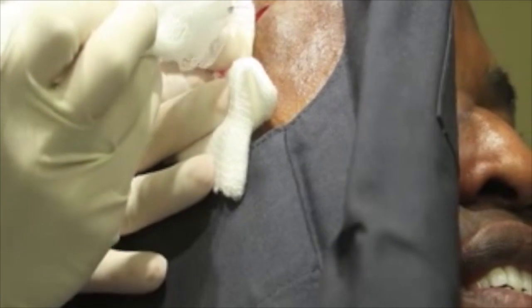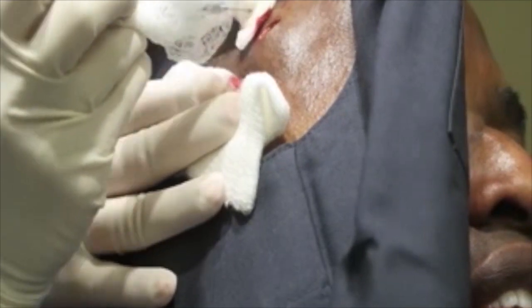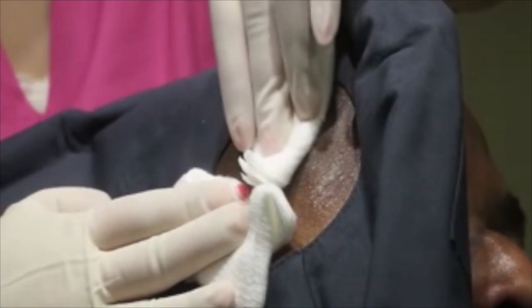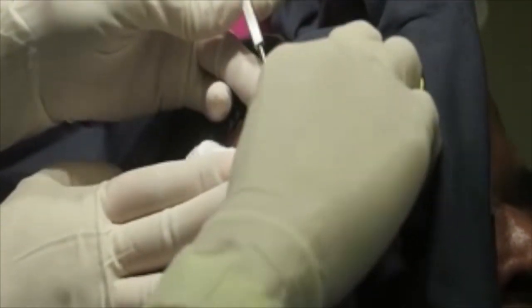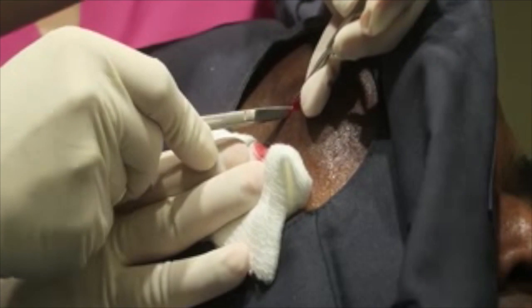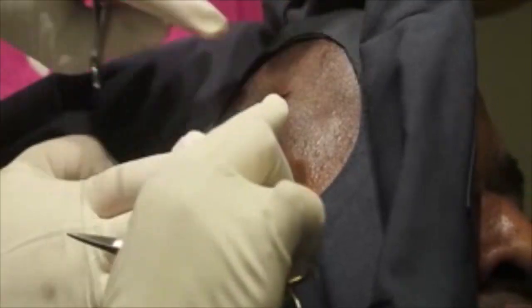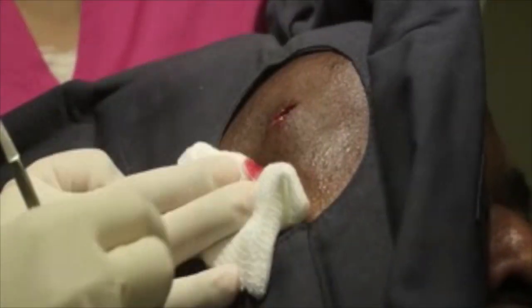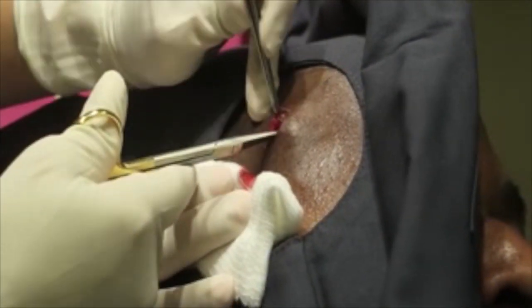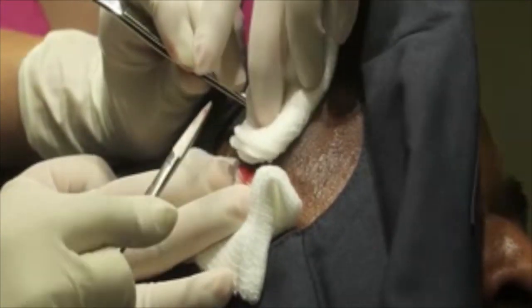A little buzzing noise you're gonna hear, just a cautery that stops little blood vessels from oozing. Okay. Alright, I do think you have a lipoma. I'm just trying to loosen around the edge and see if I can pull it out there. So again, nothing should hurt. Let's see if I can pull that, because I don't think I can push it out. Pop out, nope. There we go, please. Thank you. Let's see if I can get under anything. Down in there.